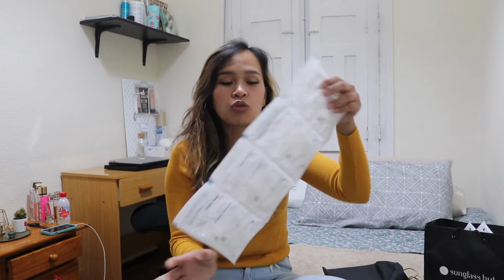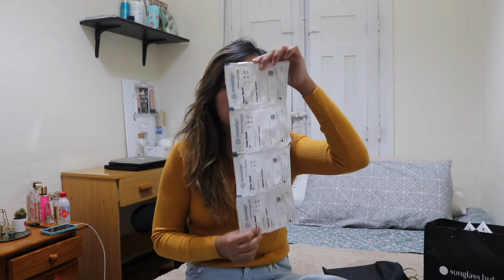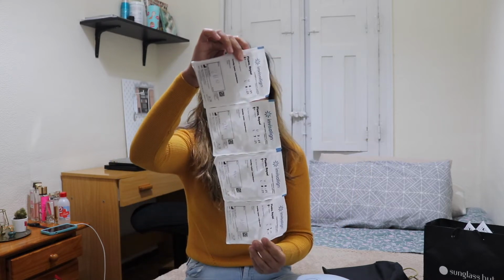At first, I got 21 liners. Each week you need to change your liners. With the traditional braces, you have an adjustment every end of the month when you visit your dentist. But with Invisalign, you have adjustments four times a month. It doesn't mean you go there every week to get your teeth adjusted by your dentist. For one month, you're just going to give him four liners. Example, this one. You're going to give him four liners, right?